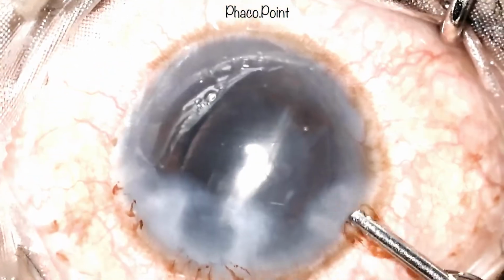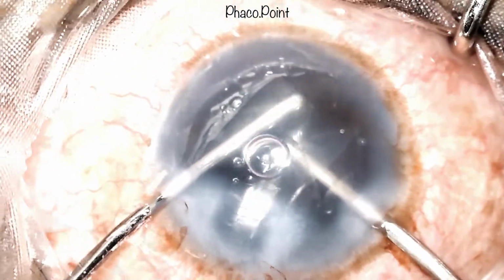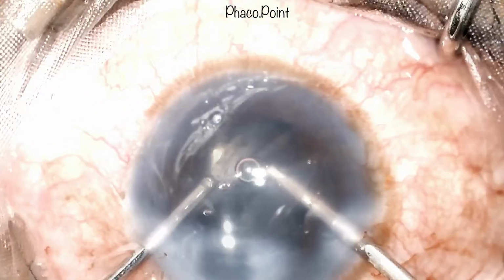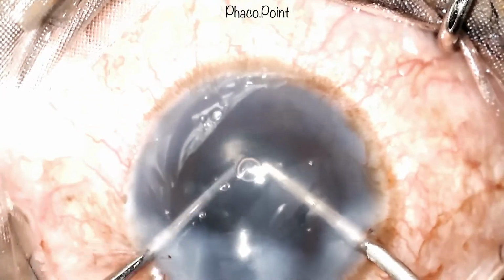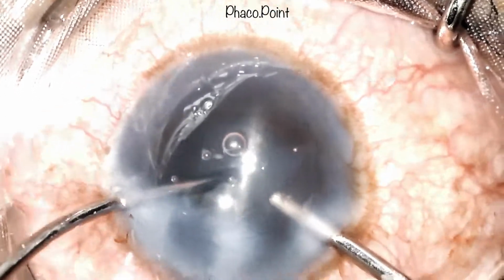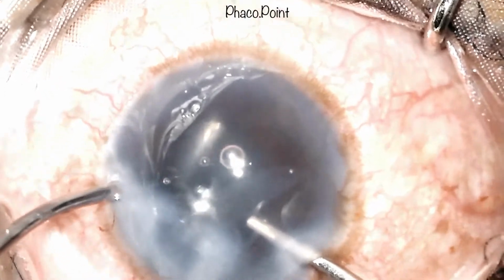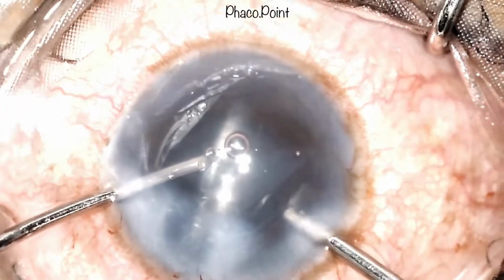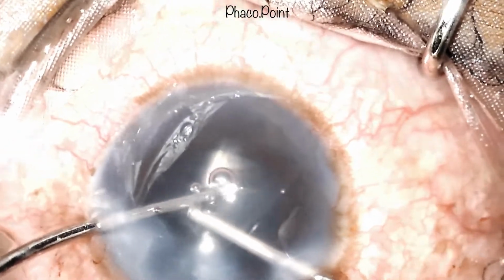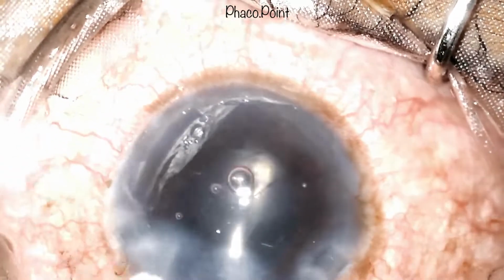Following the successful implantation of the IOL within the capsular bag, a very gentle visco wash is performed without disturbing the Descemet's membrane, which lies quite close to the corneal endothelium. Upon the completion of the visco wash, both the instruments are removed from the eye.